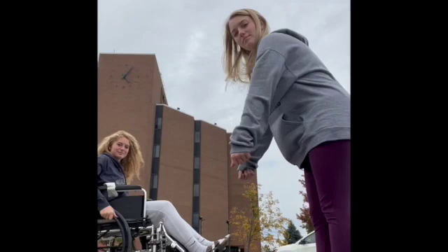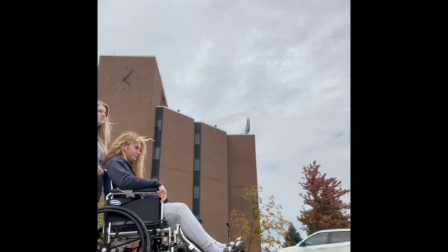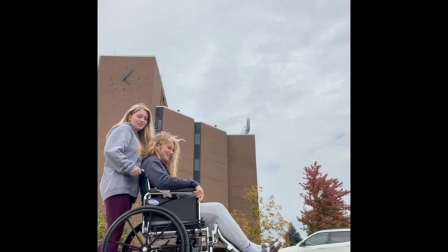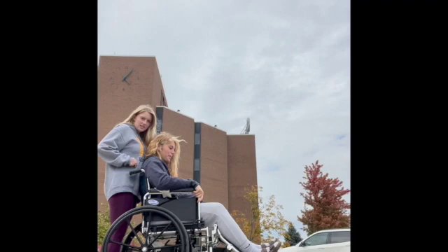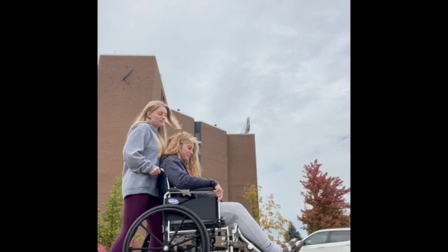To push a patient down a curb, tell the patient they're going to feel some bumps and to hang on. Slowly approach the curb, hold the hand grips firmly, compress your abs, and ease them down. Then lift the front wheels back up and you're done.